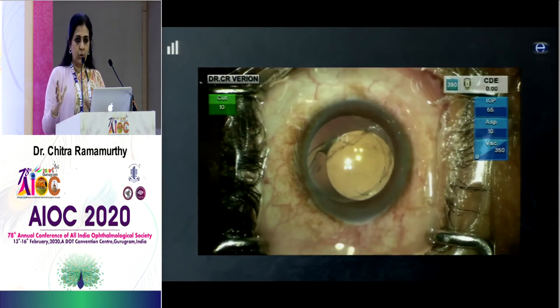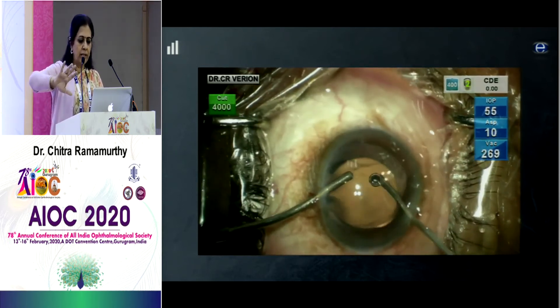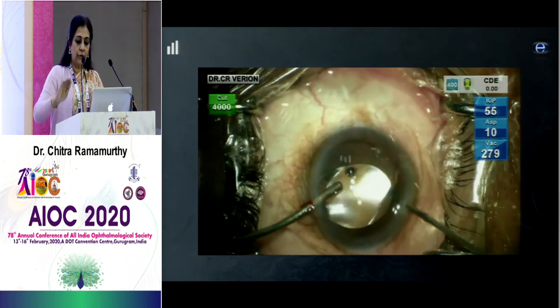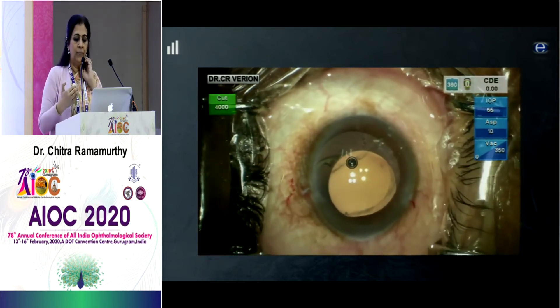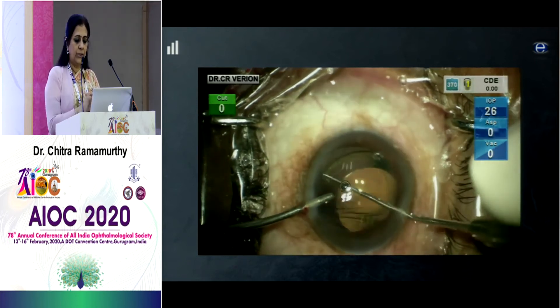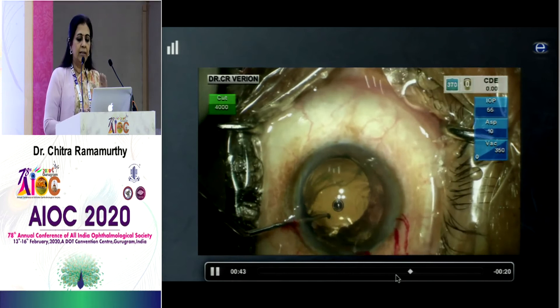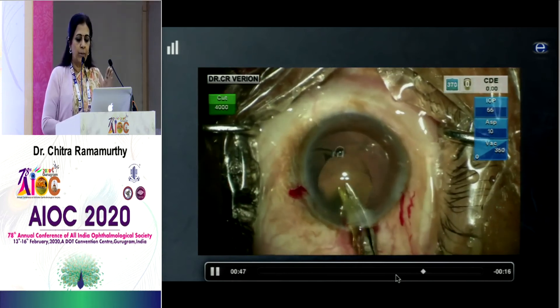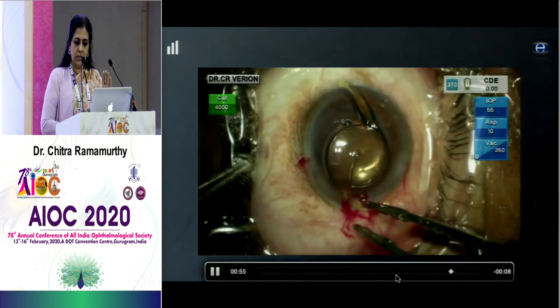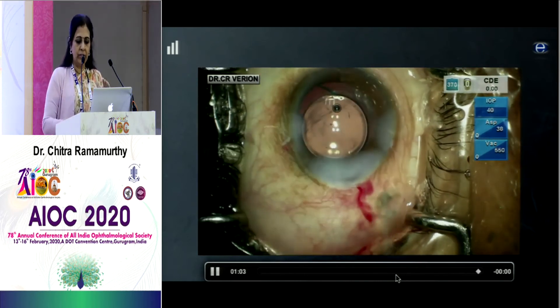This is a case where the patient came to us with a torn bag and a single-piece IOL already in the bag. There is vitreous present. First, I do a good vitrectomy behind and in front of the IOL. Then I nudge the haptic out of the bag — you can see it coming out — and enlarge the incision, because I realize this IOL has no place with that kind of posterior capsular support. I bisect it halfway, pull the IOL out, check that the IOL has been fully removed, then inject a three-piece IOL onto the sulcus, do any residual vitrectomy, and get out.